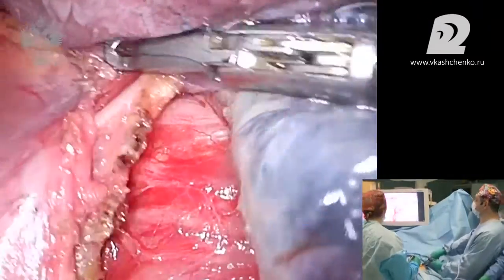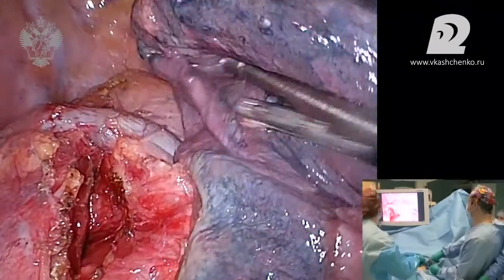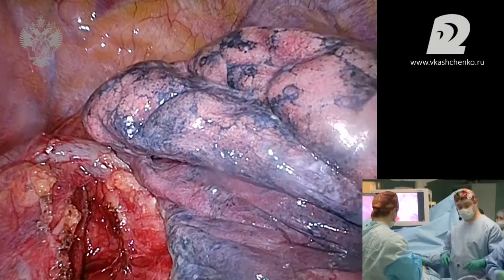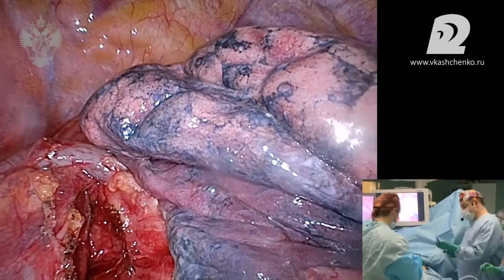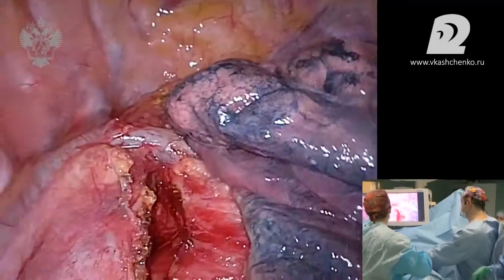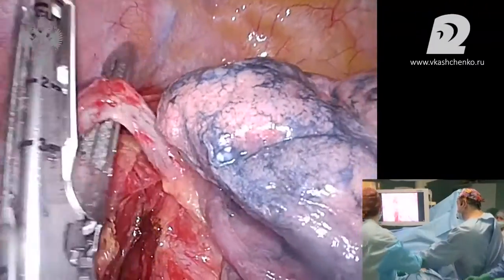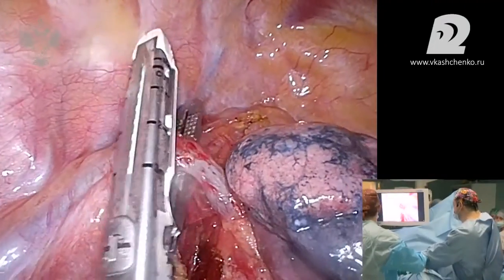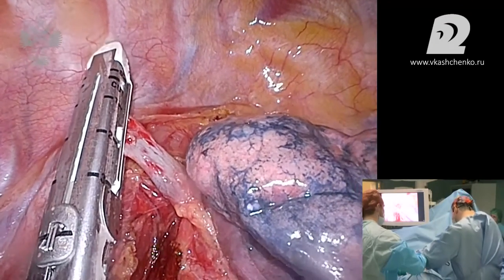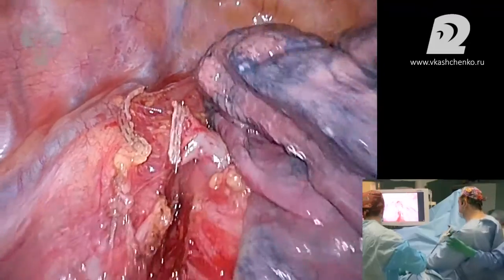Do you have something there? No, it's not placed very deeply there. Okay. We are going to cross the azygos vein, and it will allow us better peritracheal dissection. You can cross it. This azygos vein can be also crossed by means of clips and also by suture equipment. So the suturing device is something that we prefer. The distal end, I recommend you to make it as short as possible, because otherwise it's going to get in your way. So the vena azygos has been crossed.